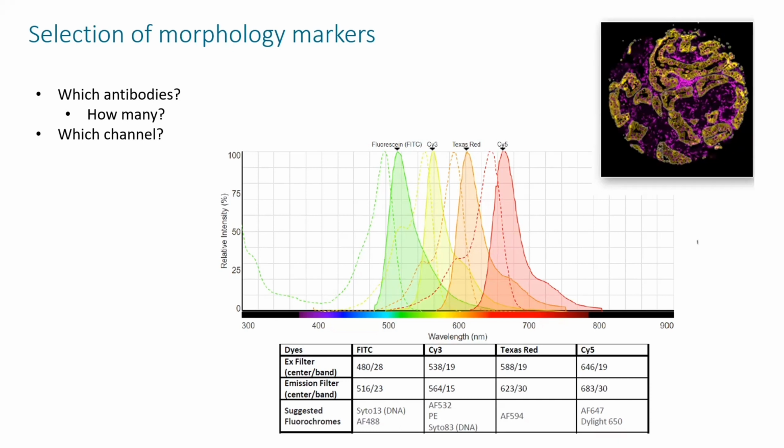And then what we do when we get the samples is what we call a dry run, meaning that we do a run in the lab, but without the expensive profiling reagents. We just add the antibodies or RNAscope probes, and then scan it in the GeoMx, and then we can see whether it's actually possible to select the cells that you're interested in.